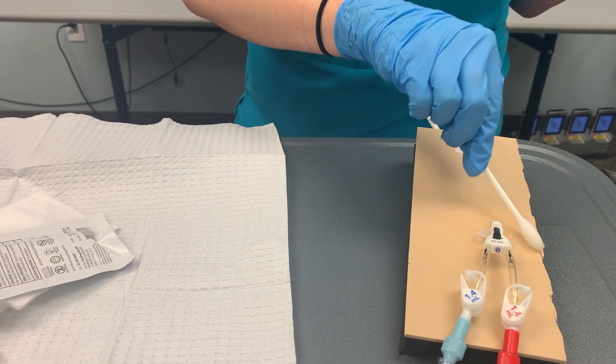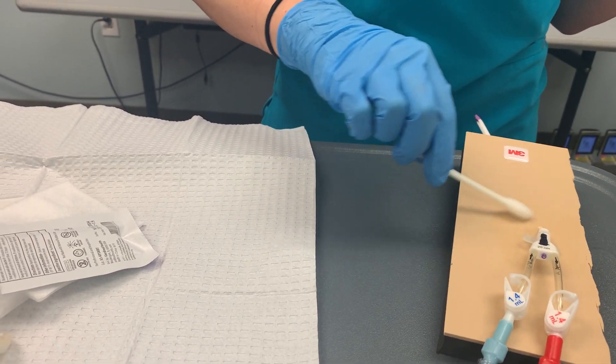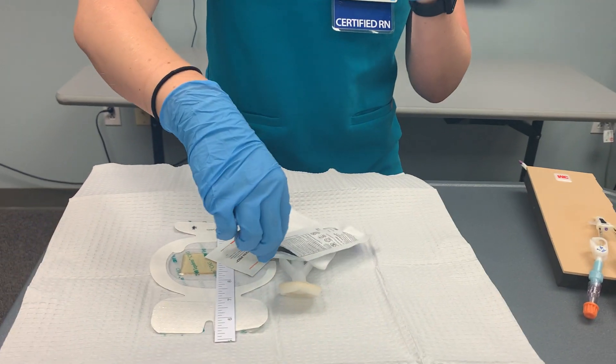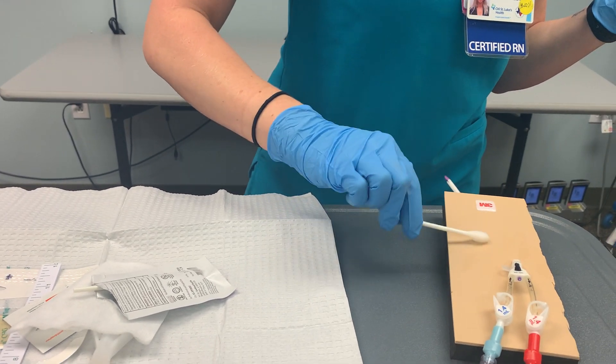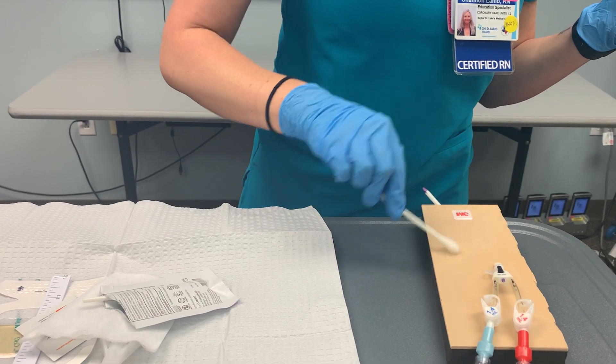If the patient had quite a bit of blood or dried serous material, you would probably need to use more than one stick. I'll throw that one out and grab my next alcohol stick. For this one, I'm going to clean out a little bit further, cleansing the skin and removing any debris from underneath the dressing.